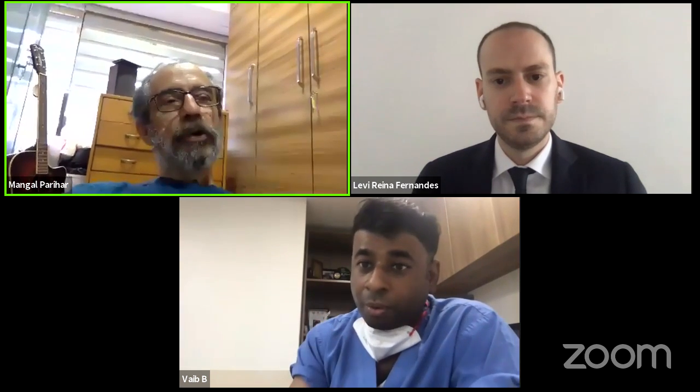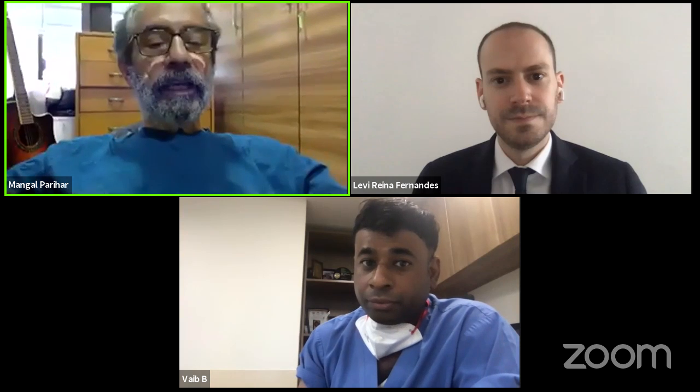My question is, what do you define as joint? Is it just the joint line, or when we call it extra-articular, does it mean an extra-ligamentous deformity? That means that we must know the attachment of the SMCL on the femoral side and on the tibial side. Okay. Yeah, but for me, an extra-articular deformity is one which is more than 7 centimeters away from the joint line on the tibial side, and more than 3 centimeters away on the femoral side. Oh, you are talking about whether I will be able to correct this deformity by a replacement, or whether it needs an extra-articular osteotomy.